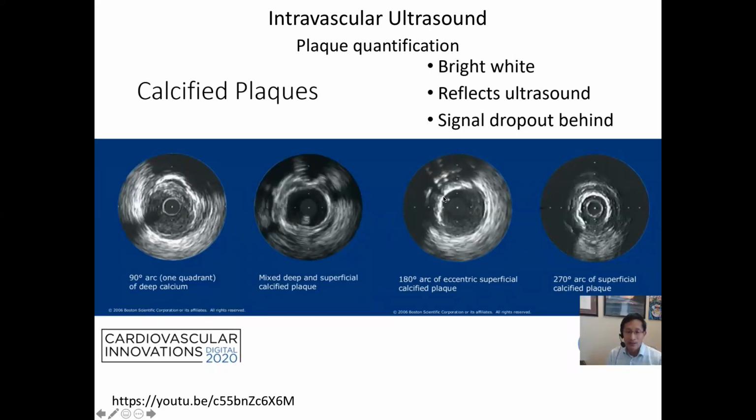We have an arc of high calcium right in the intima, and then I don't know what these are out here, if they're artifacts or true calcium beyond this one, but I think these little wisps here are that echogenic artifact, the bouncing from the calcium back to the transducer, back to the calcium, back to the transducer. And here's some superficial, that's a lot of calcium on the outside of this. The whole thing's dark around it, right?